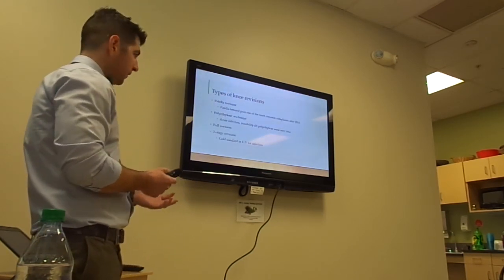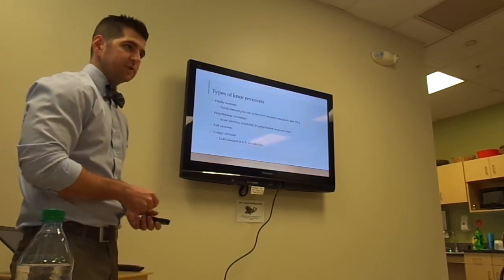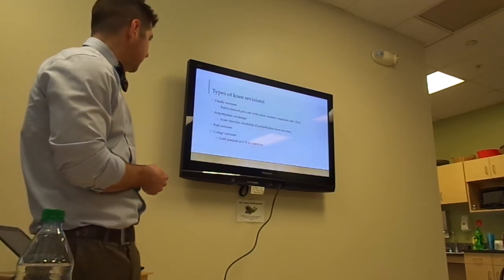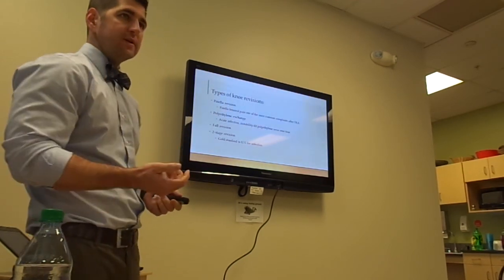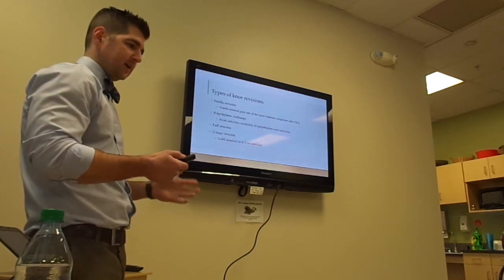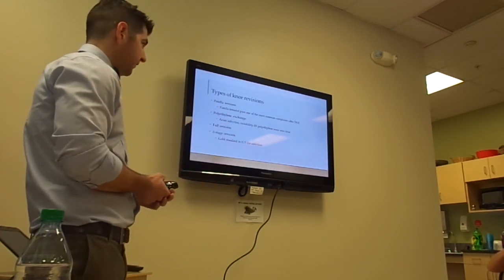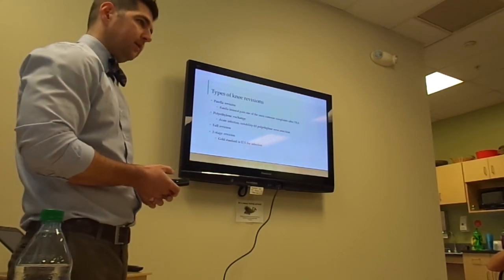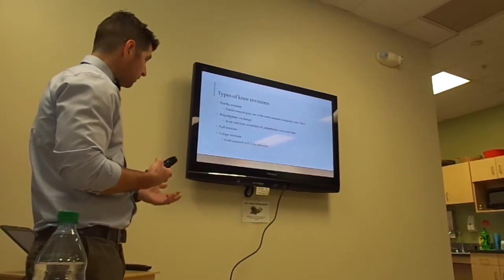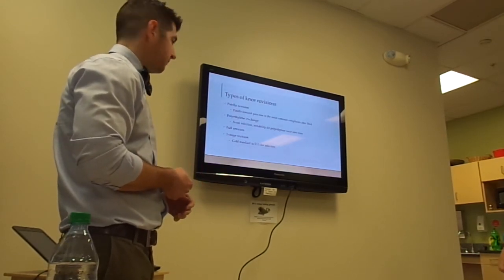Types of revisions, you've probably seen the whole gamut of it, from patella revisions or even a polyethylene exchange, or pretty simple surgery. They recover pretty quick, sometimes even faster than a total knee. That's because it's minimal soft tissue surgery, minimal bony surgery, and basically we're kind of trying to restore the ligaments out to where they should be for them. Oftentimes they're either further down the road and they just need a bigger piece of plastic put back in, or maybe they're a year or two down the road and they've loosened up, or they just weren't tight enough to start off with. Full revision, we take everything out, put new stuff in, and those probably take a little bit longer to come back from because it's more bony work.